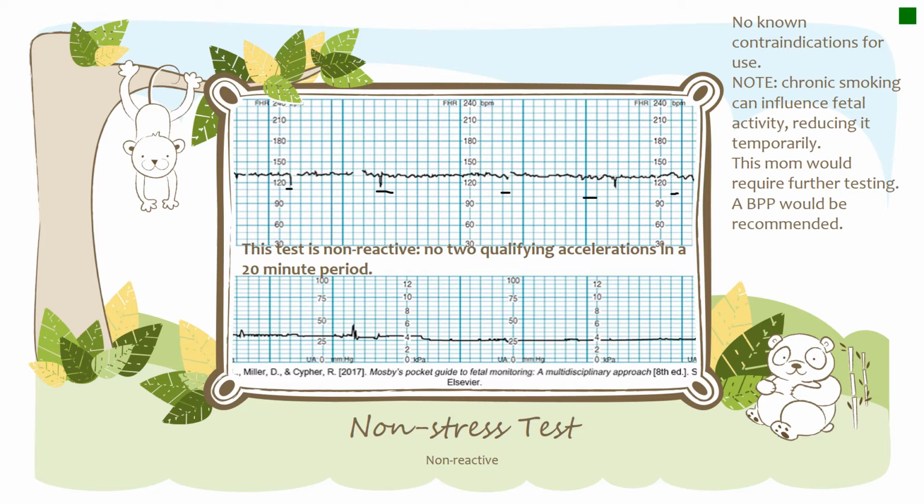So we're going to say this is a non-reactive non-stress test. Again, chronic smoking can influence this fetal activity. With this particular test, because there are not 2 qualifying accelerations in this 20-minute period, we are going to let the physician, the care provider, know, and most likely a BPP would be recommended for this particular mom.